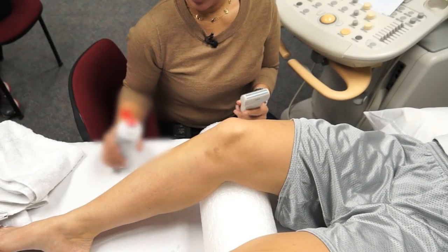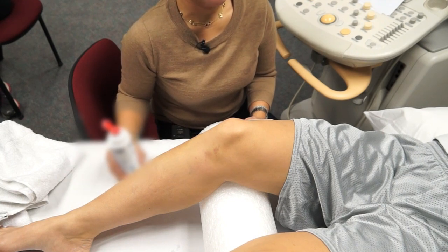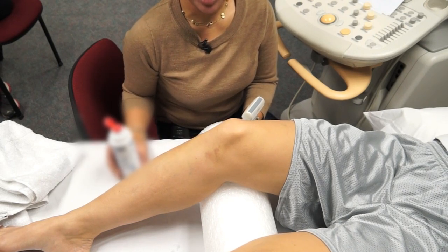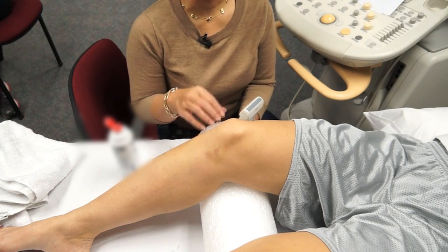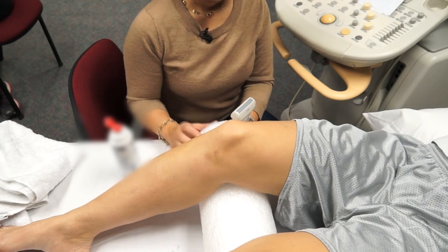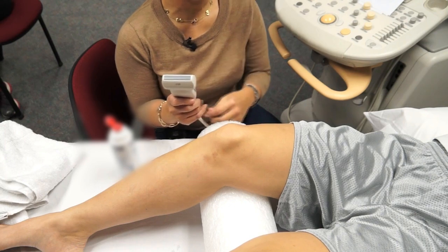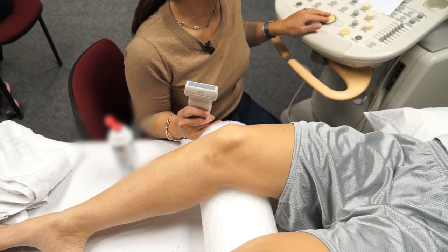Just like when imaging the elbow, it's useful to image the knee in compartments, or divide the knee into 4 compartments. So for this part, we'll be doing the anterior part of the knee first. And for this, we have the patient supine. You may want to put a roll or a pillow or a towel to have the knee partly flexed and have the patient relaxed. We'll be using a linear 12 megahertz transducer with the presets on the machine set to general musculoskeletal.